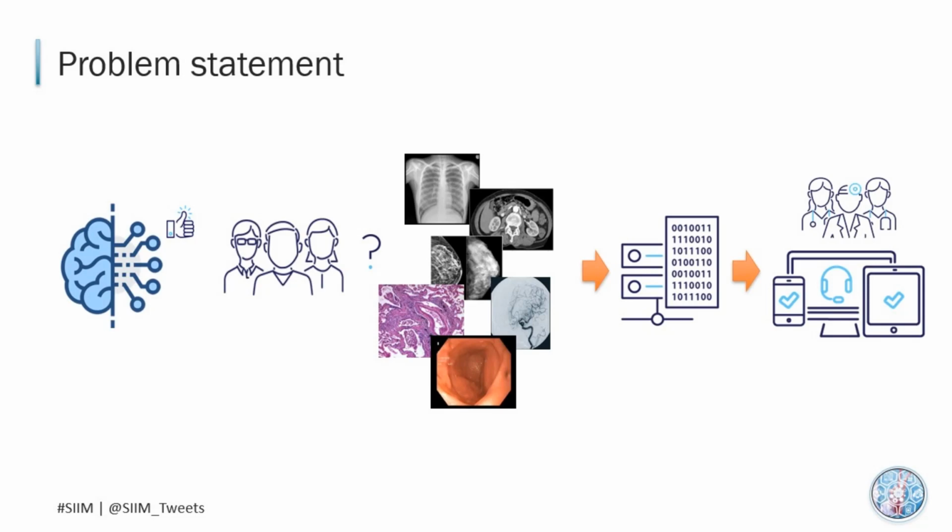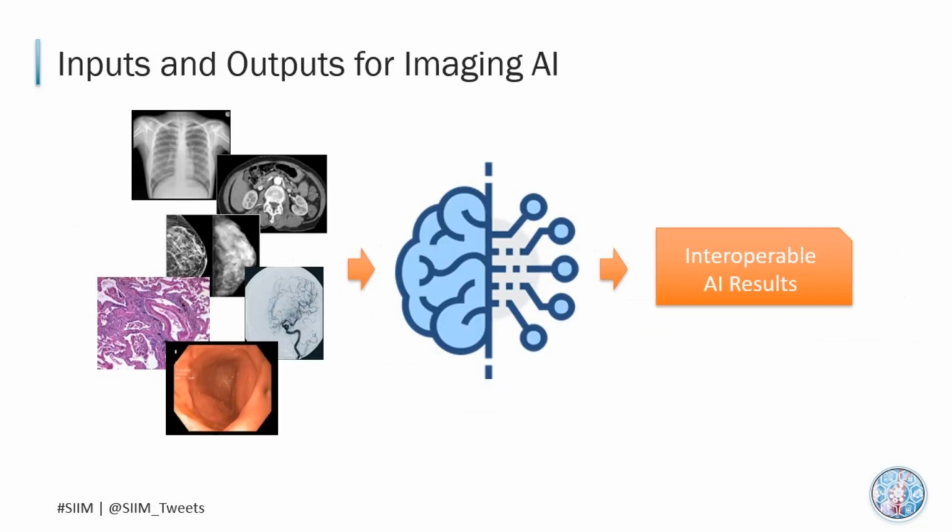That sounds like a good problem to have. I think I can help you here. Obviously, your algorithm will focus on specific object types to look for specific characteristics. Fundamentally, your AI model will need to understand any DICOM objects in general and produce some interoperable AI results such that this downstream system can understand.